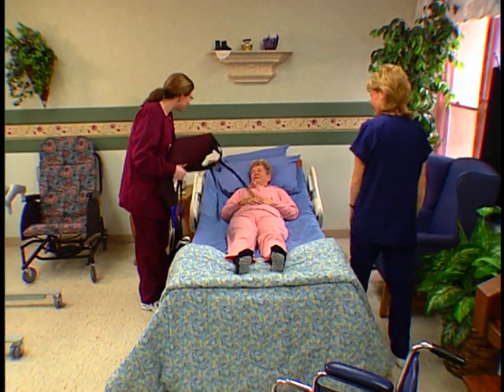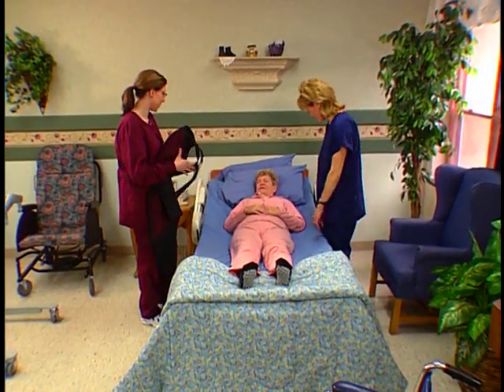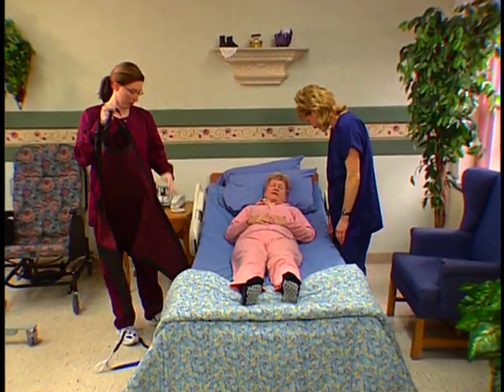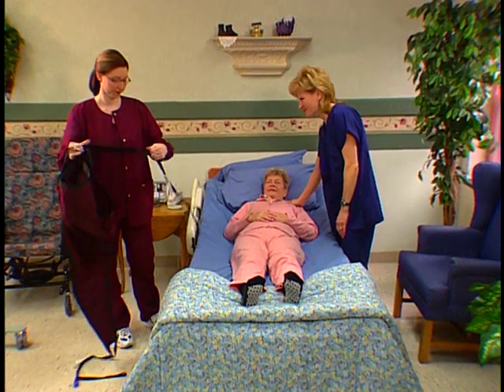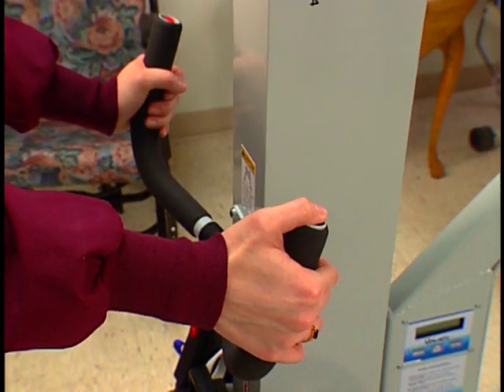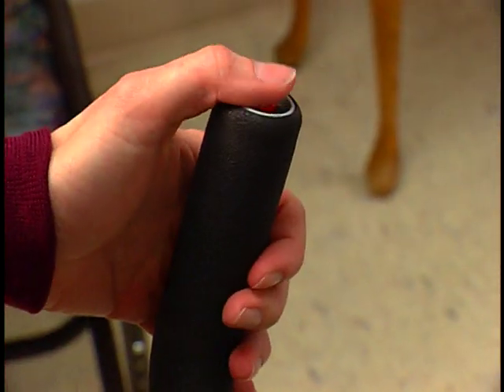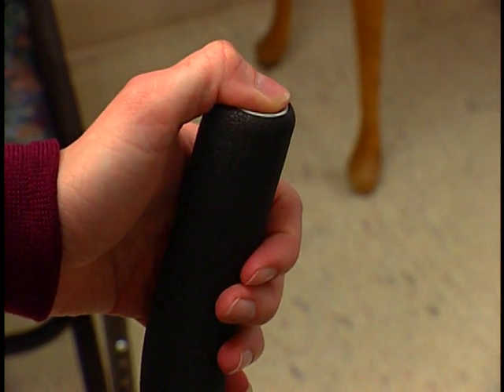Each caregiver must be familiar with the health condition of the resident. Review the person's chart to be sure the proper equipment is being used for that particular patient. With the proper equipment selected, inspect the mechanical condition of the items, always correcting any deficiencies prior to lifting.